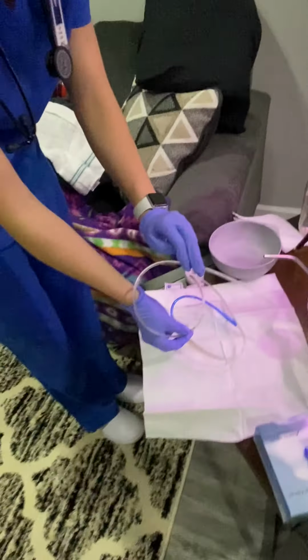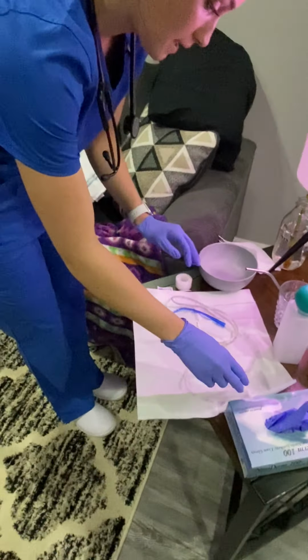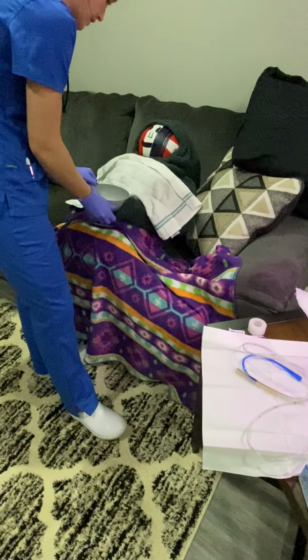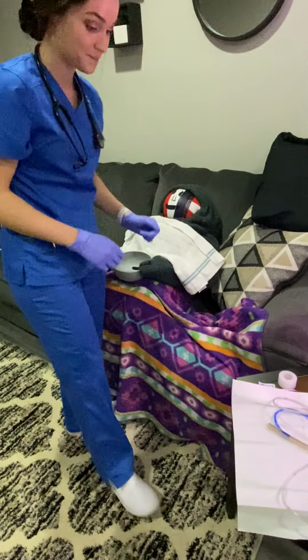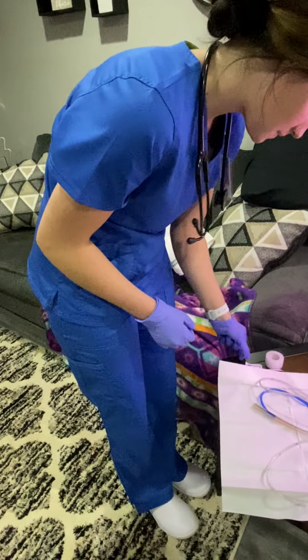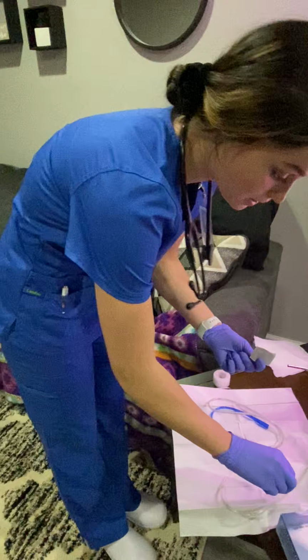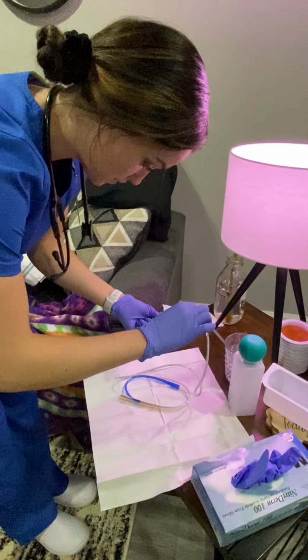So I'm going to come over here. That's ready. I'm going to put the emesis basin in front of my patient in case she needs it. And then I'm going to put my water-soluble lubricant 3 to 4 inches down the NG tube.